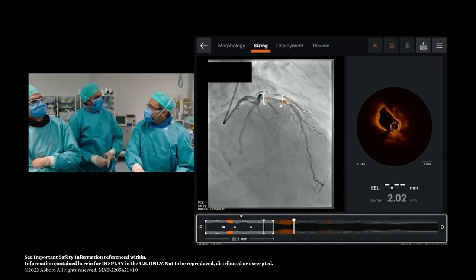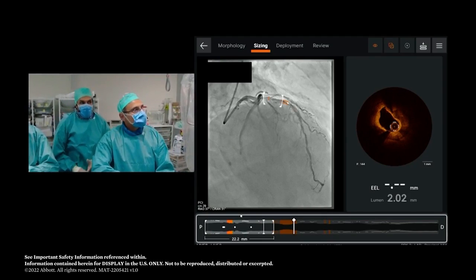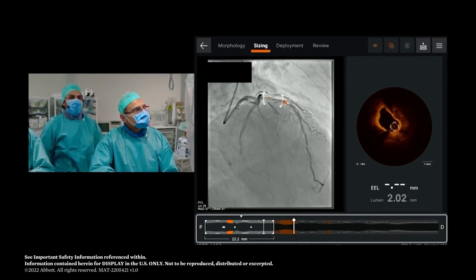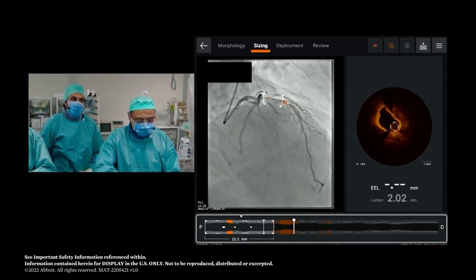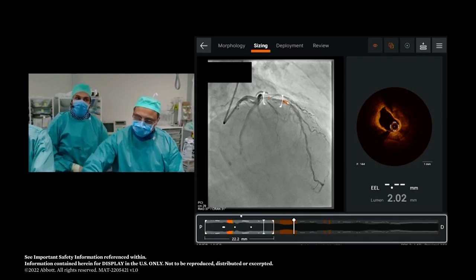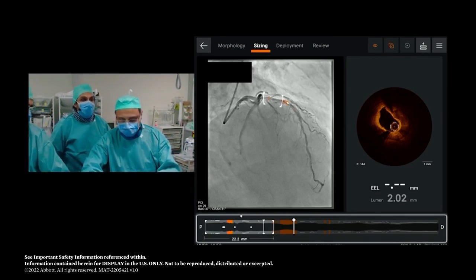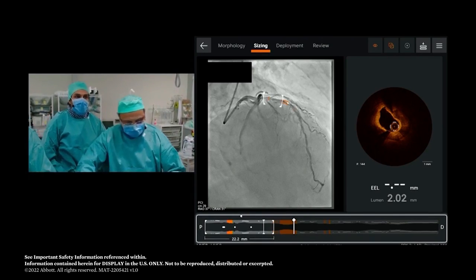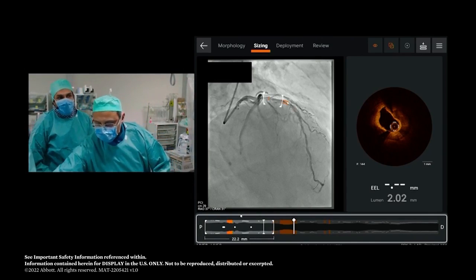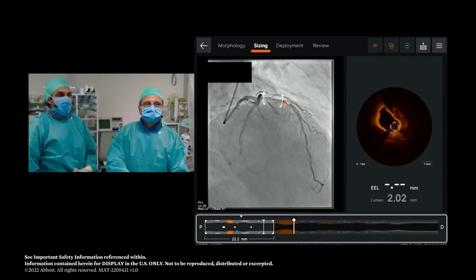Okay. So Carlos, the first stent is in. This 3.5 by 18 millimeters, what is OCT telling us with the proximal stent? So OCT, first of all, I'm pretty happy, Emanuele, that you landed exactly where the co-registration helped us to know where the landing zone was. And that also allows me to understand what is the length that you need to cover the proximal part of the vessel. Based on the OCT, you see there on the screen that we have now measured from where you have landed to the very proximal part of the LAD, and it's about 22, probably a little bit more because we don't have the complete proximal part. So we're selecting a 28, 30 millimeter stent, 3.5 for the proximal part of the LAD. Excellent.